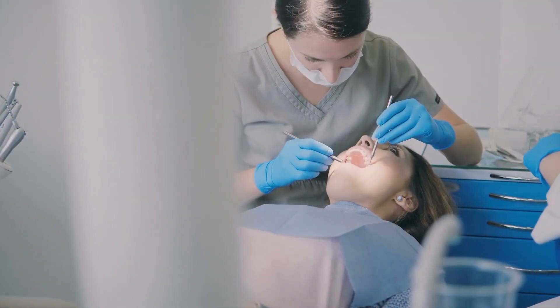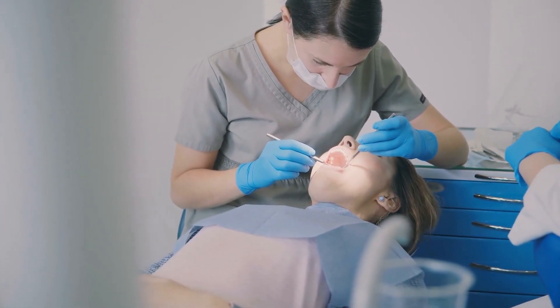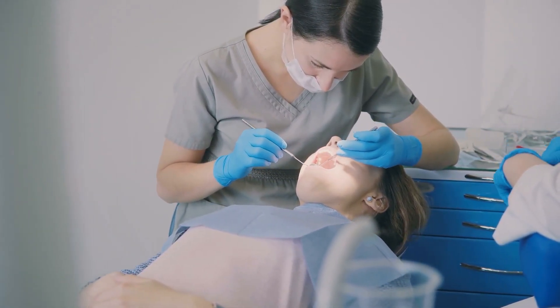But specific to the teeth, when we are doing cosmetic dentistry, you probably know somebody that has tiny teeth. What it really is, is the gums are a little bit lower on the top and on the bottom they're up. We call it a gum lift. It's just a little bit of Novocaine and we can laze — just take it off so you're exposing more tooth and it looks fuller. The analogy is kind of like removing the cuticles on your fingernails.